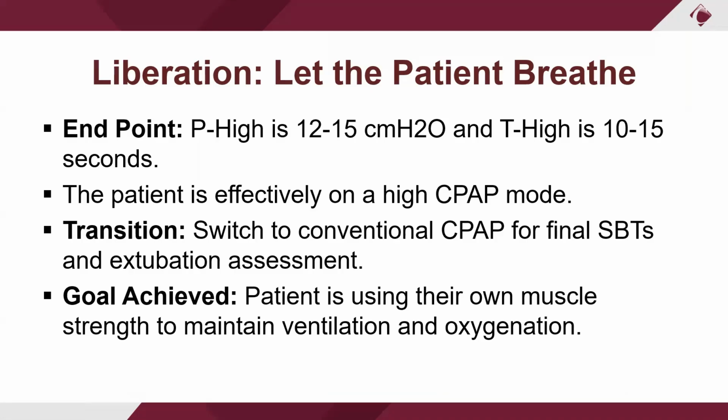So again, where you're supposed to end, there are different protocols out there. But if you get somebody down to a P high somewhere between, I've heard numbers like we go to 15 and 15, we go to 12 and 12, we go to 10 and 10, whichever you think is right.